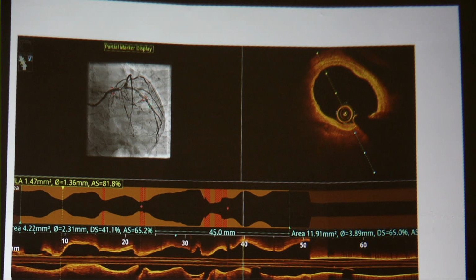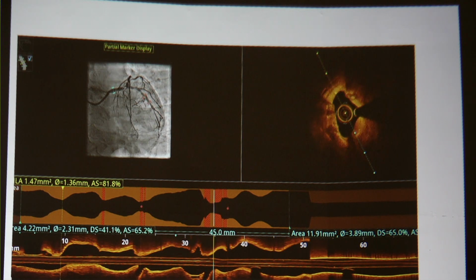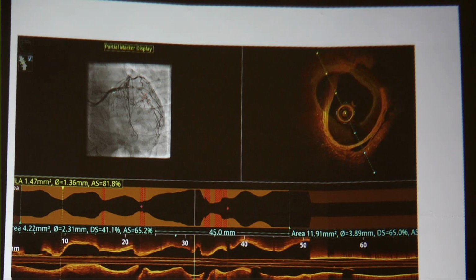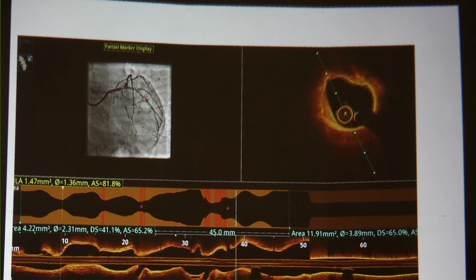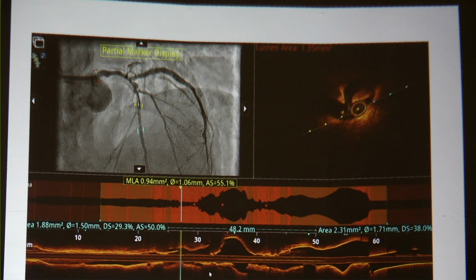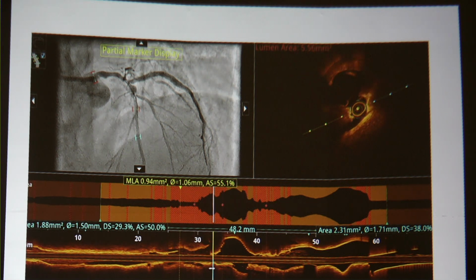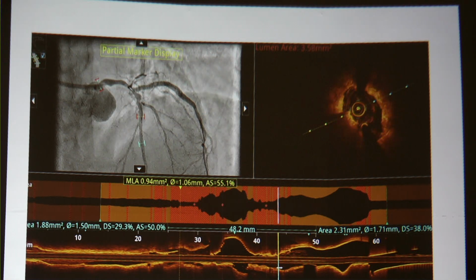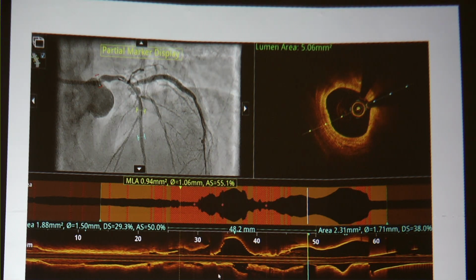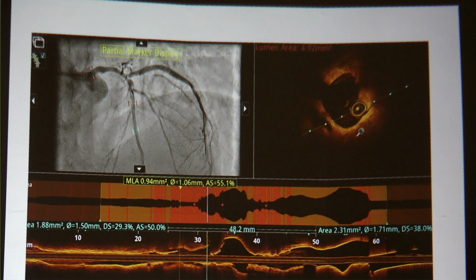And look at this nodule. See, there are different types of nodule. One is, this is a classical eruptive nodule. You just concentrate here. There is the break in the intima. That is, there is no cap for this calcific nodule. This is very common in acute coronary syndrome. And many times, eruptive nodules can get compressed easily. You cannot equate all nodules as the same thing. There are some nodules, whatever you do, in spite of IVL, rota, orbital, they don't get treated. It is left there. The only thing is, be cautious about it for the stent expansion and malapposition.